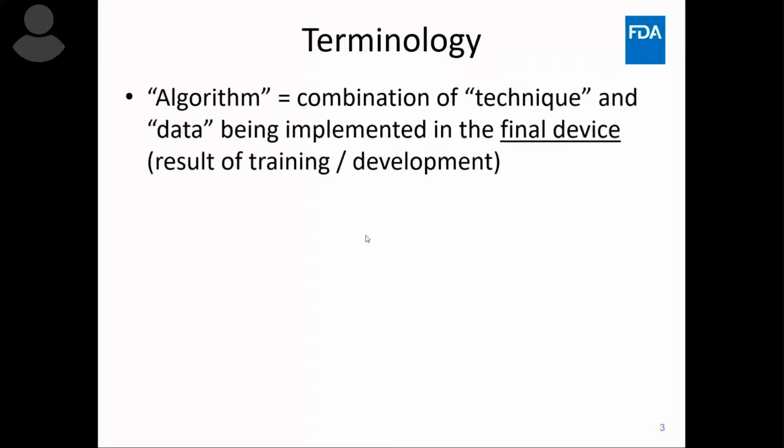In addition to that, let me define an algorithm as a combination of a technique and the data that is going to be implemented in a final finished device. For simplicity, because I'm not very good at saying algorithm, I will say device, and I mean an algorithm that is implemented in a software medical device or software as a medical device.